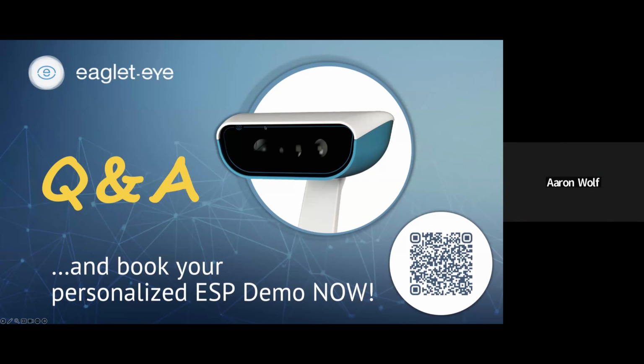Yeah, I agree. There's a few things here. With traditional topography, there are certain things that matter, like even the direction the eye is in, like if it's fixated directly on the target, or slightly nasally fixated, things like that. It'll change your map a little bit. The nice thing with Eaglet is you've got these 2 projectors that are coming from the side, so you're going to get really reliable, accurate data, even if the fixation is not always exactly on.